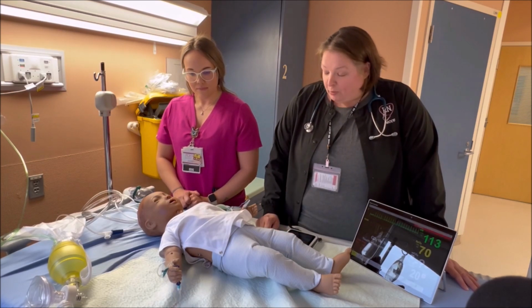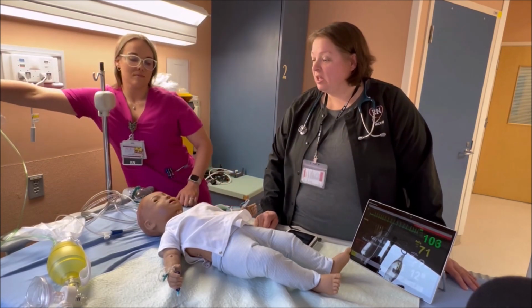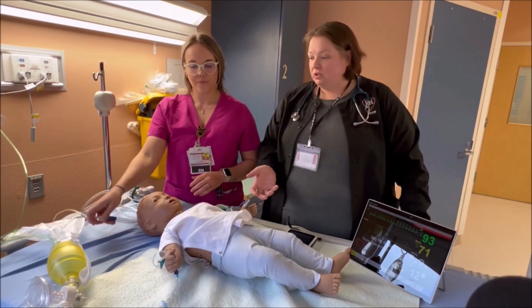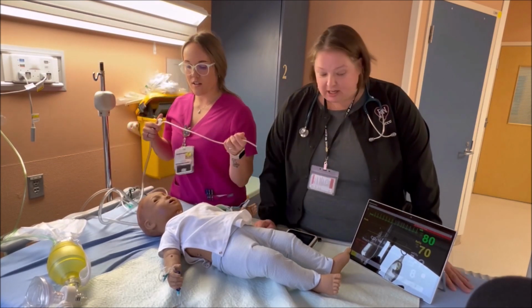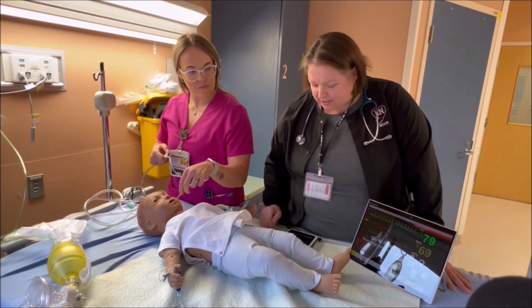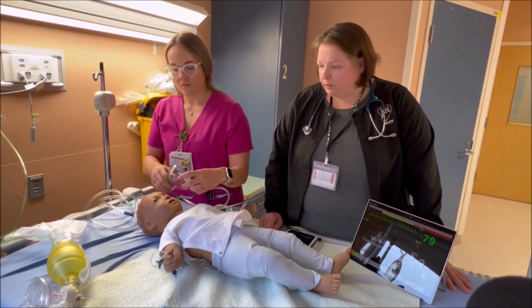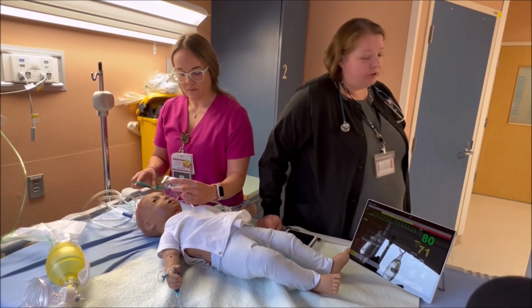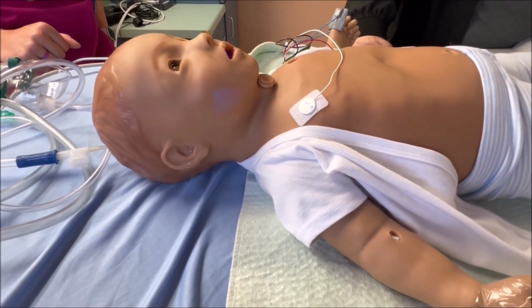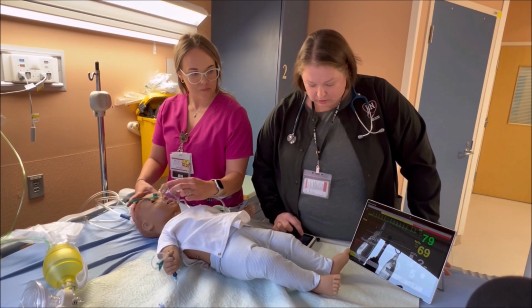Right. But we have to be ready for anything. And oh gosh, I think we're actually seeing him starting to seize. And one of the things that we want to make sure we're looking after is the airway first, and might need a bit of suction. Keep him safe. His oxygen level is going down there, Katie, too. His O2 sat is in about 69 to 70. I wonder if we can apply some oxygen. Meredith, can you please call the doctor and also get someone else to prepare some medication for the baby because he is having a seizure right now. We need some help. And suction, oxygen on. Good job.